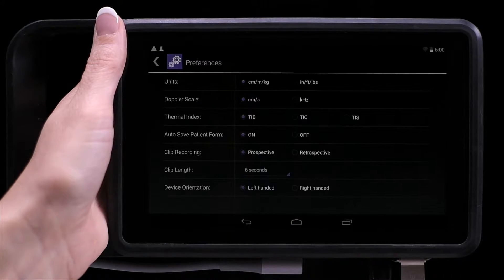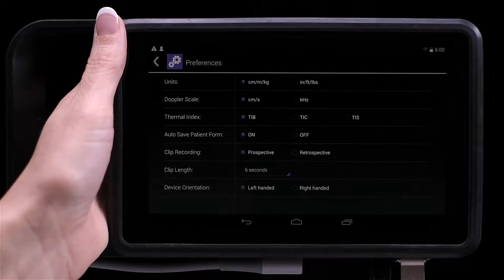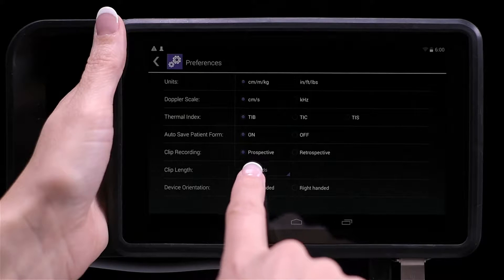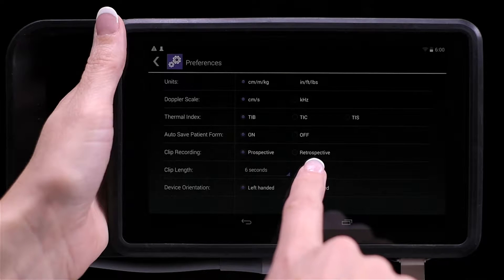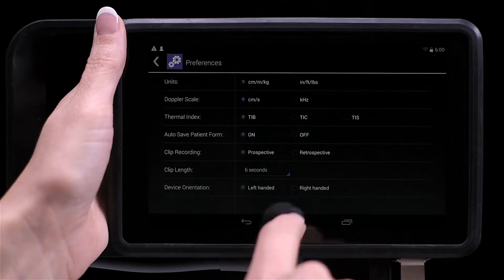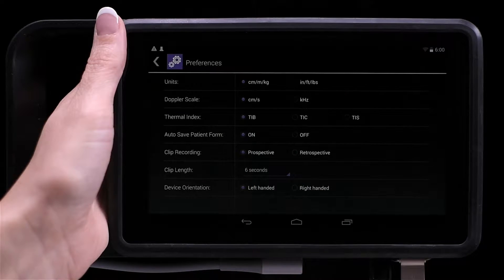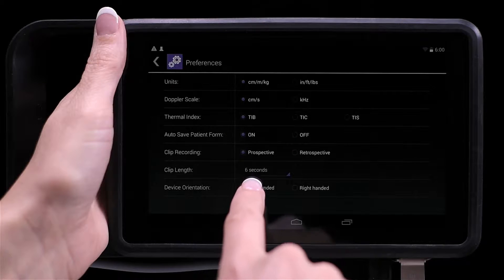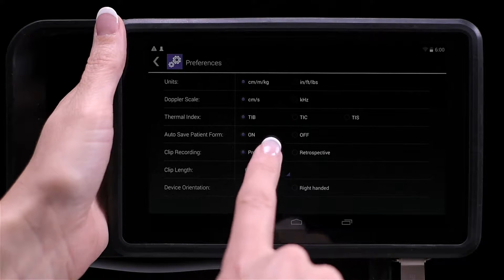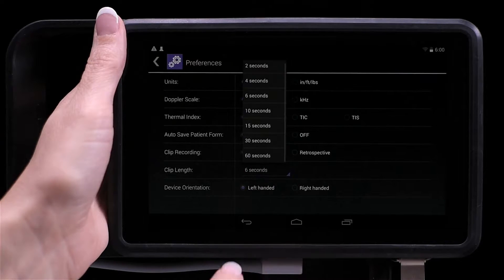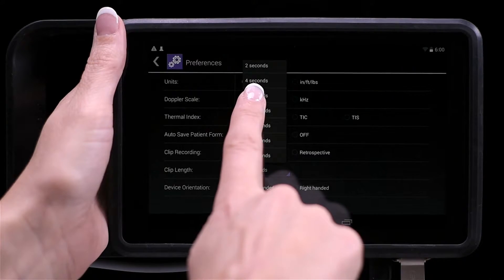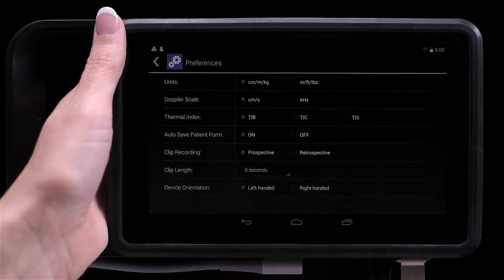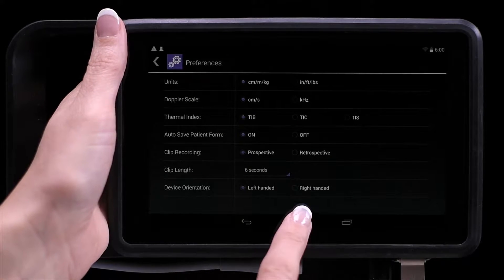On the preferences screen you can choose either prospective or retrospective for the clip recording type. You can also select the length of the clip up to 60 seconds. We'll choose six seconds as our default length.